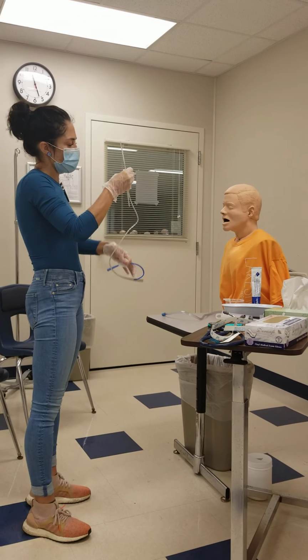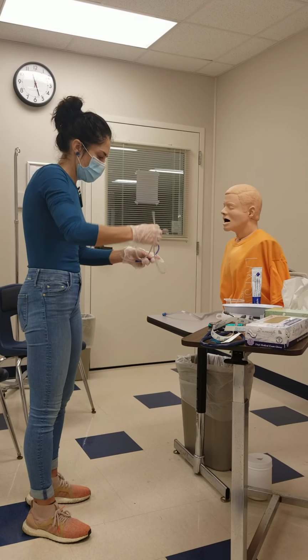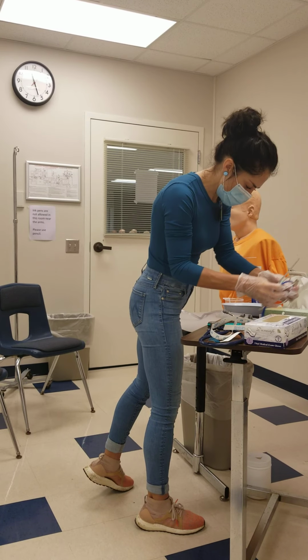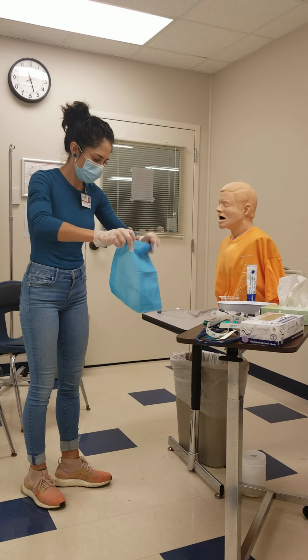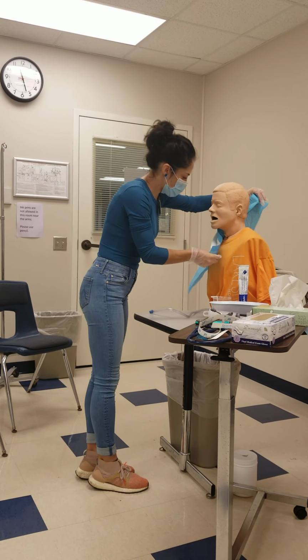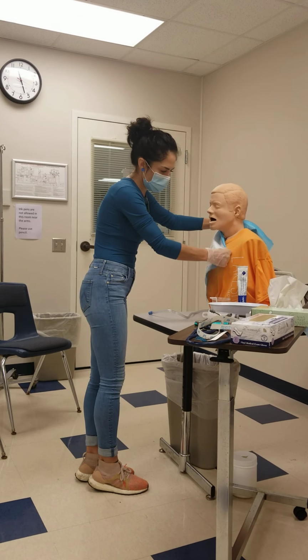Okay, and I've taken this out of my package. All the expiration dates are good. Okay, put that on. I'm going to stick that back in my package here real quick. I'm going to drape my client, just because it's going to fall off.